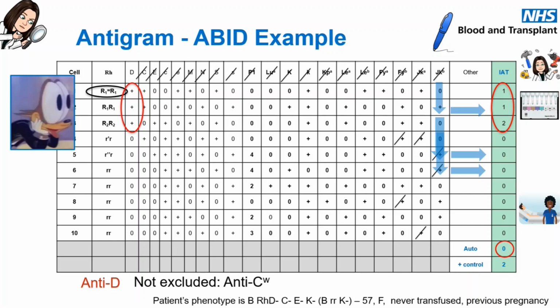So this would just be a positive cell, an antigen positive cell. I would tend to use, say, line 2 against a weak anti-K anti-sera, just to show that the incubation has worked. Because if you got a result where this was completely negative, how do you know without doing an incubation control that the tests actually worked? So it's just a way of confirming that your tests worked. I hope that helps.